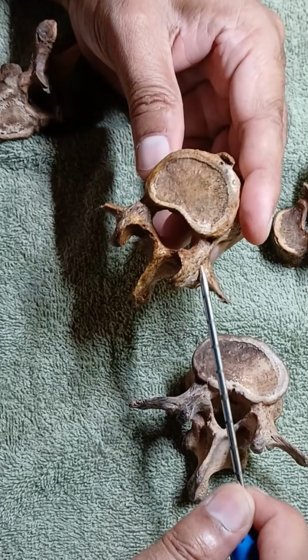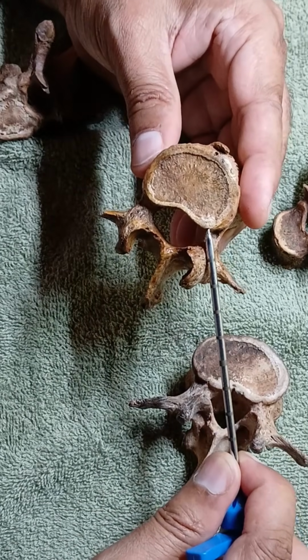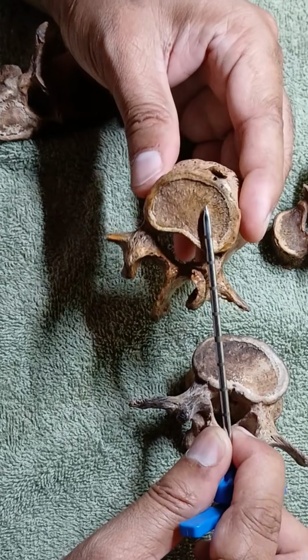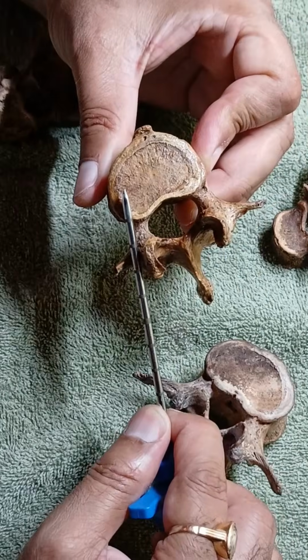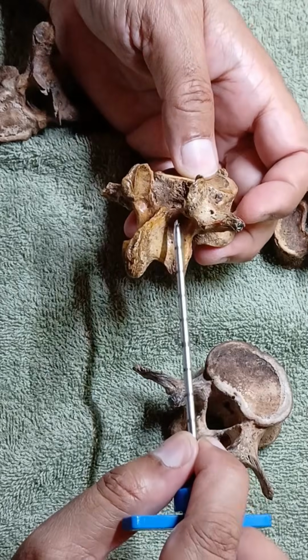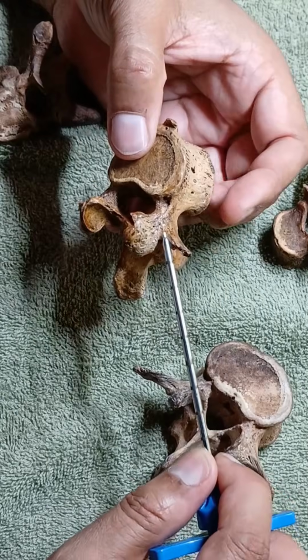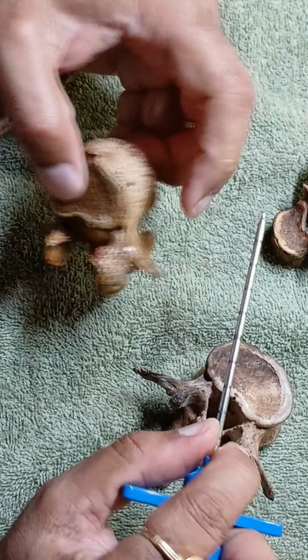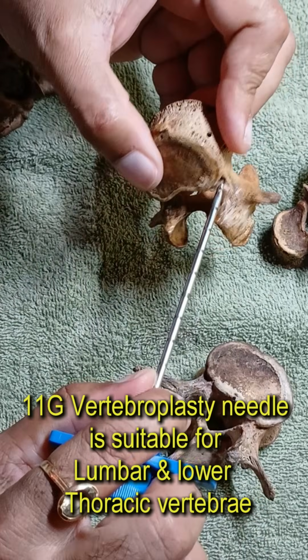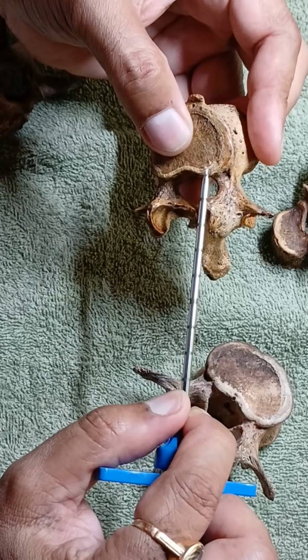Some people do the vertebroplasty procedure with one needle, but usually I prefer to put two needles. It is good for beginners also. Putting one needle here, putting another needle here. Why I am showing the real bone, a lumbar vertebra, mostly this is L3: here you can see the diameter of the needle and the diameter of the pedicle, maximum 1.5 times or double.